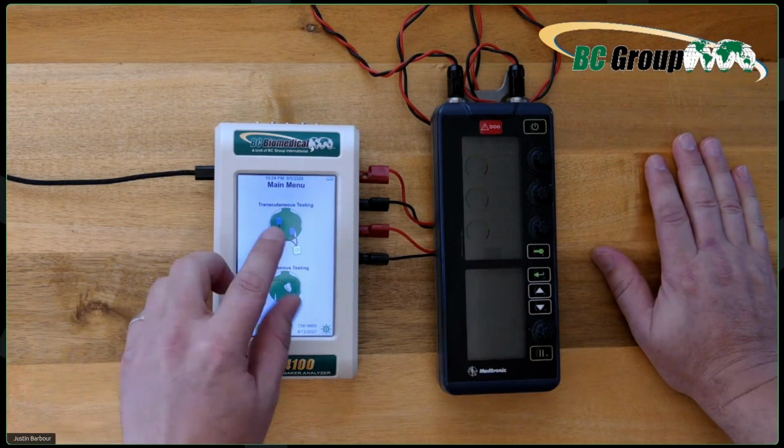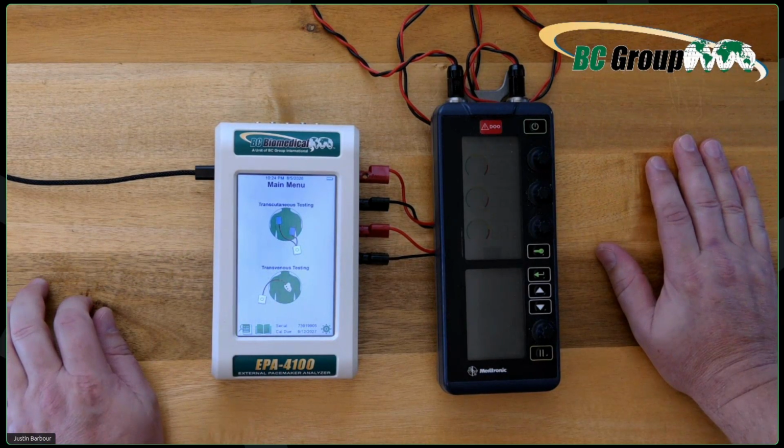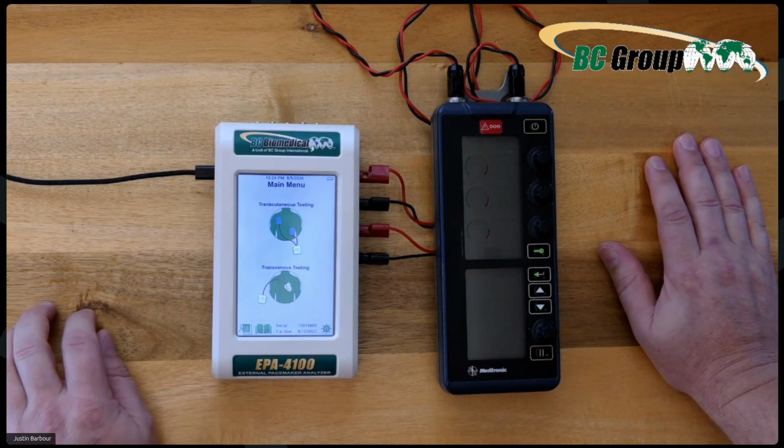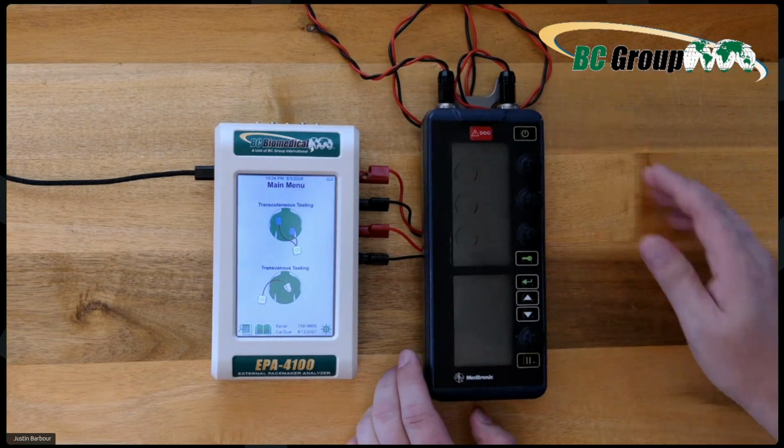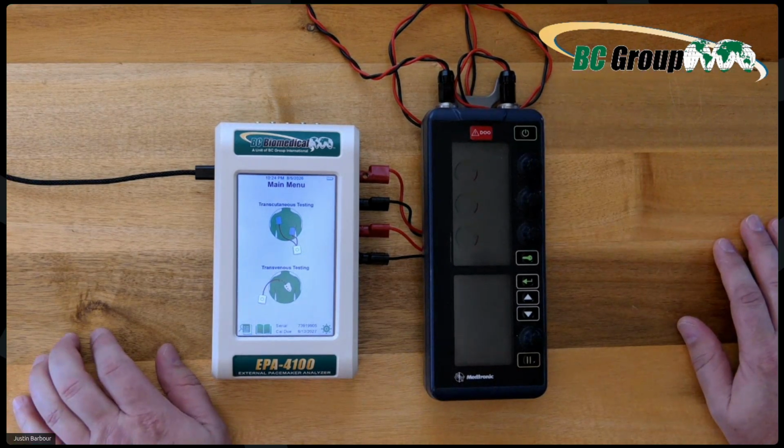But transcutaneous is going to be very typical of what you'd find on most defibrillators. Transvenous is what you're going to find very typical of like this Medtronic system right here.